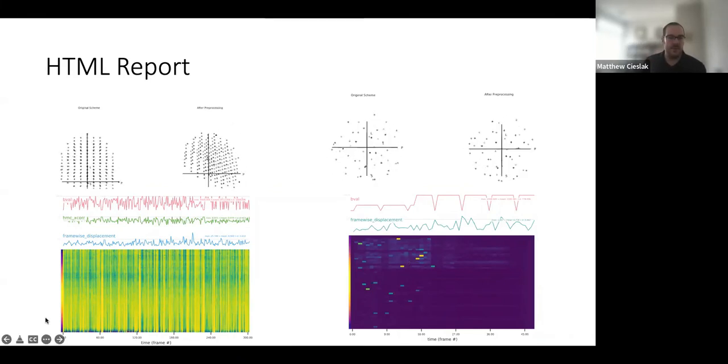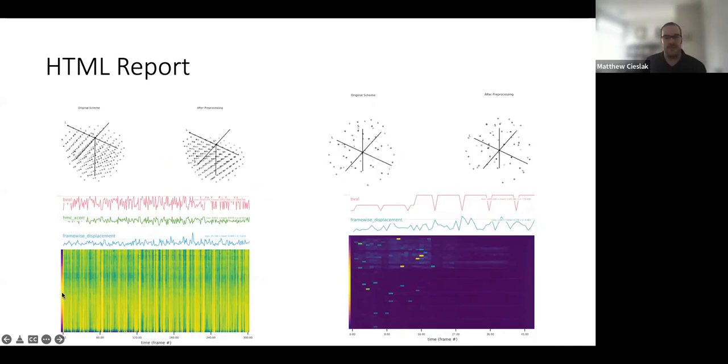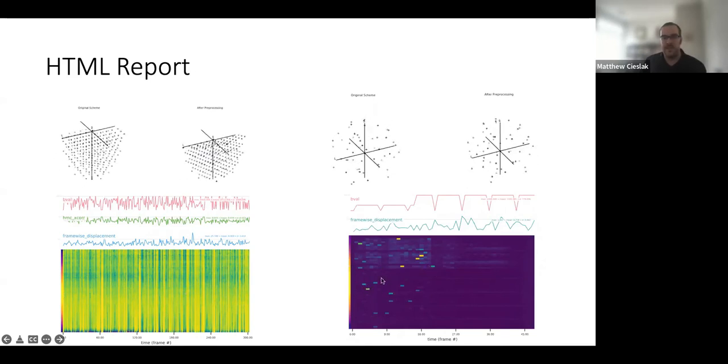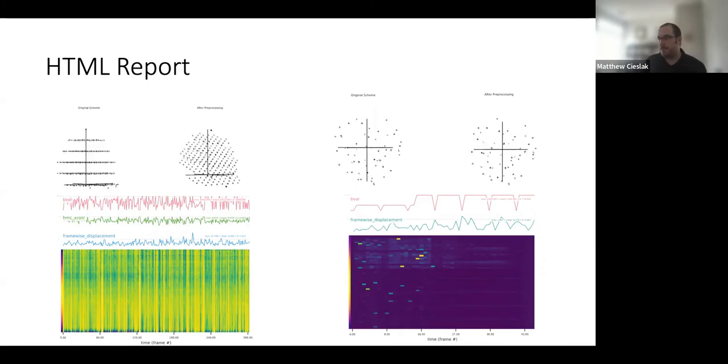And so this little bar over here shows you it's color coded by the number of in-brain mask voxels you get in that slice. So you really just want to pay attention to where we have a whole lot of brain, how big are the number of standard deviations from the expected image.